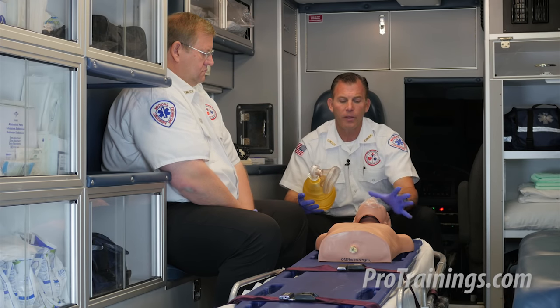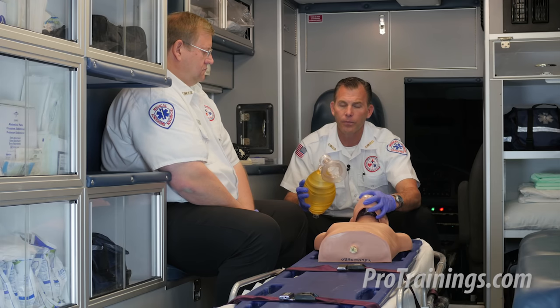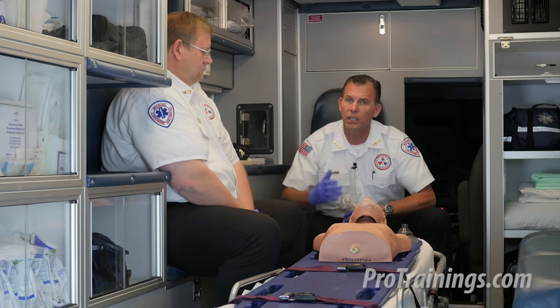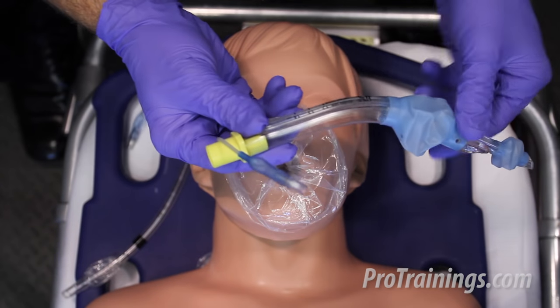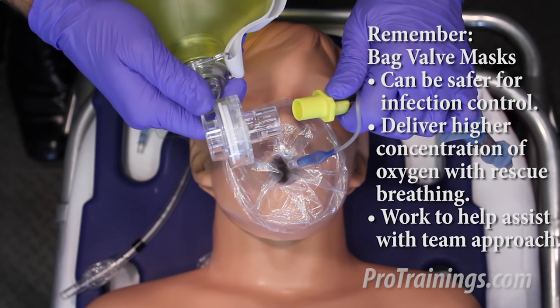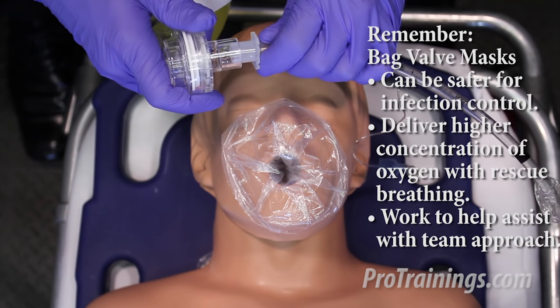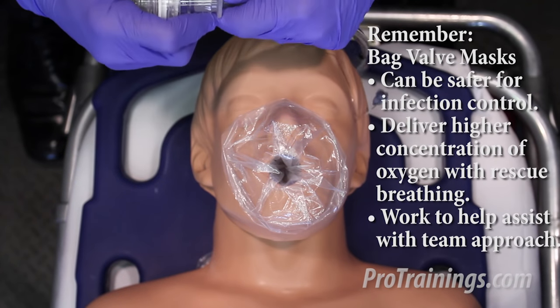On a side note, if there's no way to possibly seal the mask to the face of the patient, there are other adjuncts available. This starts getting into advanced life support and advanced airways, but it's worth mentioning. We have supraglottic airways designed to fit the actual stem of the bag valve without the mask, which can help deliver a secured airway with a rescue breath. We also have the more traditional endotracheal tubes that are designed to connect with the bag valve mask stem — and these too can assist us when the mask is not fitting or sealing.